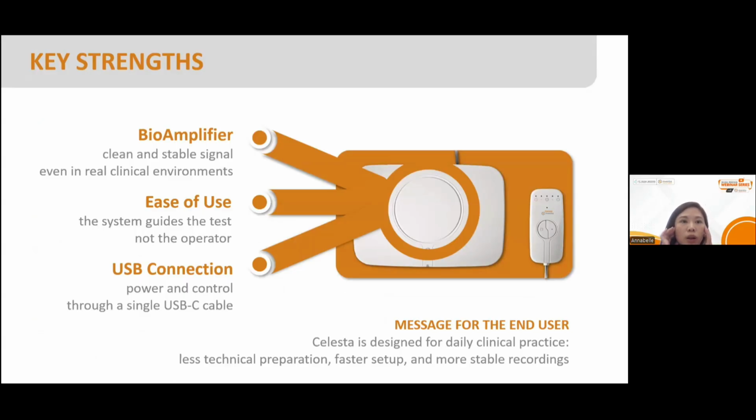I don't know whether in the past, when we did the ABR or the ASSR a long time ago, some other old brands required a very clean environment, like a magnetically shielded room, like in the audiology room, a sound booth, but also electromagnetically shielded, because the measurement of the signals is very easily affected by noises, some electrical, mechanical noises happening around.